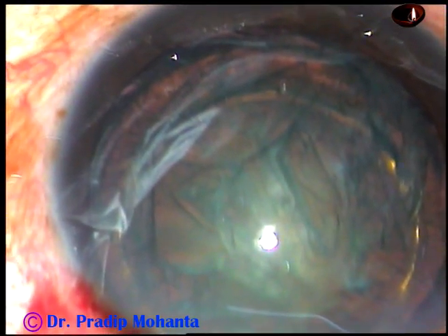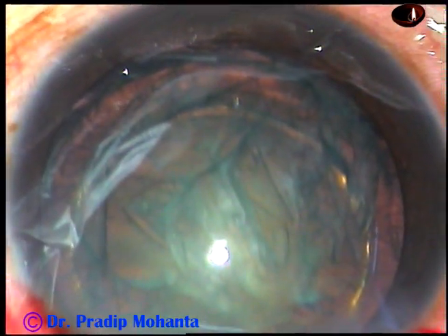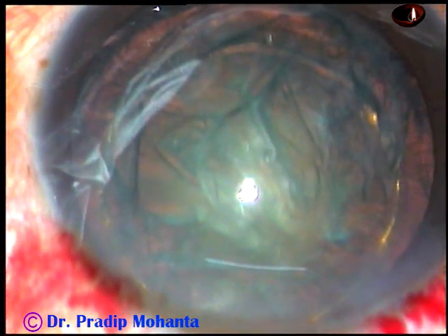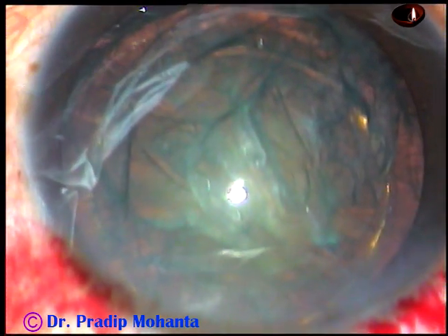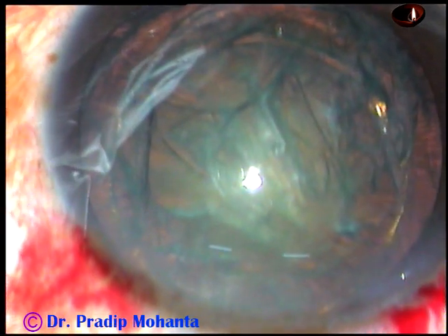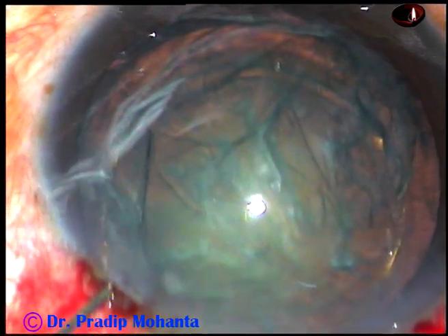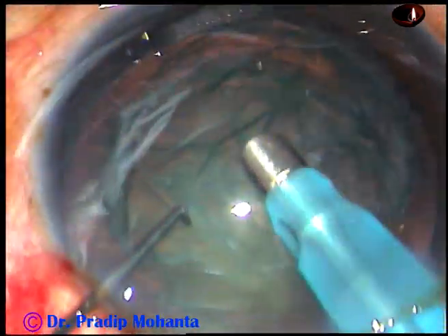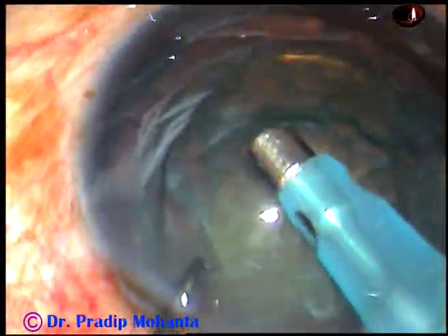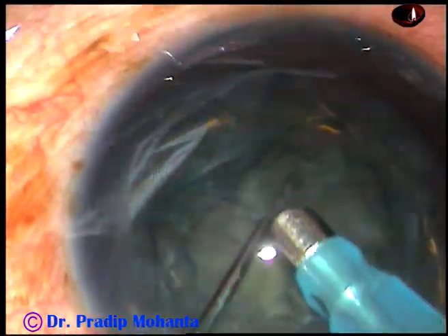Some visco has been used to fill up the anterior chamber again. The tip of the phaco needle is to be introduced. This is a 2.8 mm tip and the machine is Oertly Catarix III. We are going to use 400 mmHg of mercury vacuum and 40 ml per minute flow rate and ultrasonic energy of 60%. Though 60% will not be required, the ultrasonic energy is set at 60%.